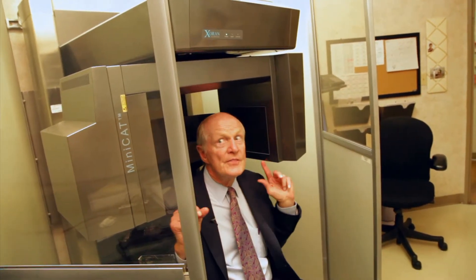So what's a CT scan of the sinus like? This is a CT scanner called a Xoran MiniCAT. It's made specifically for sinus x-rays. It's got much less radiation than conventional CT scanners — about the same amount of radiation as a chest x-ray.